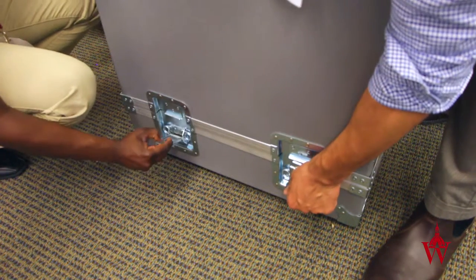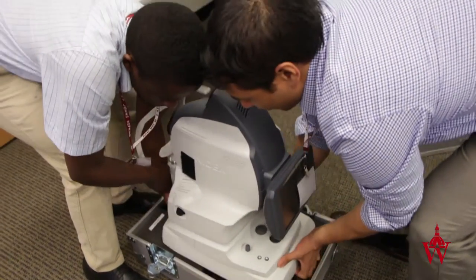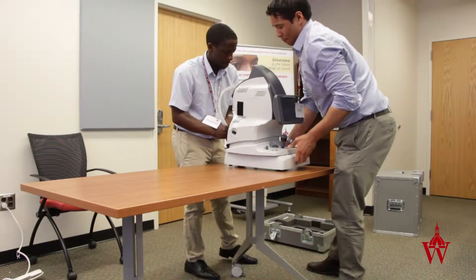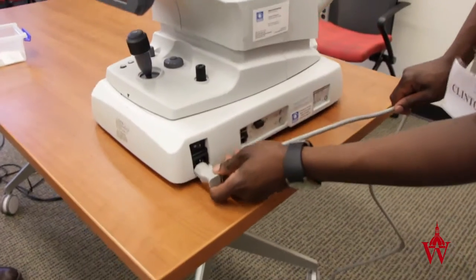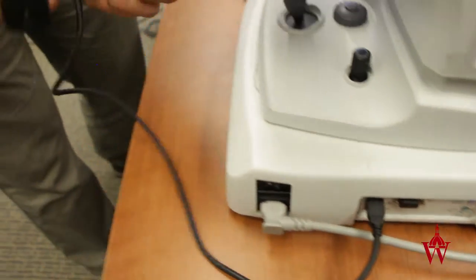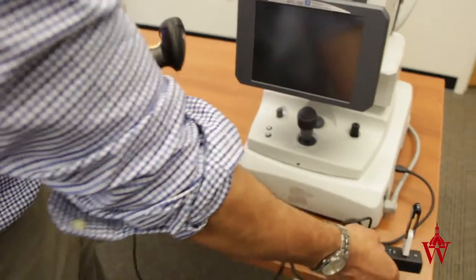Open and unlock the case. With two people, gently lift the camera from the case on opposite ends. Connect the power cord and USB port. Place the USB drive and barcode scanner in the USB port.